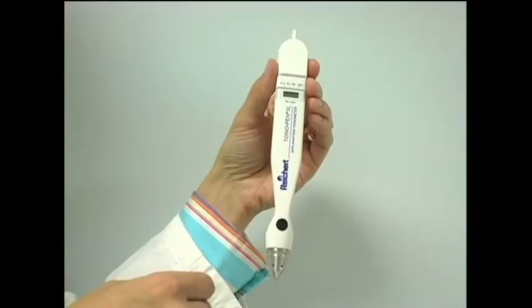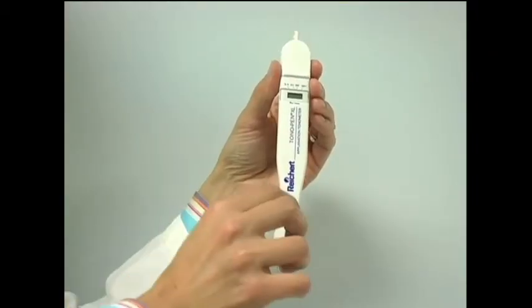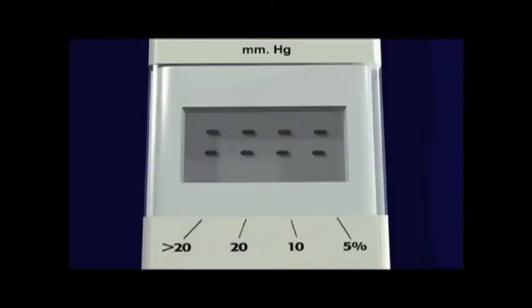To check for calibration, hold the pen straight down and press the operator button once. If you see a double dashed line on the LCD screen, you may proceed with measuring the IOP. If you see a single dashed line, the Tonopen must be calibrated prior to use.